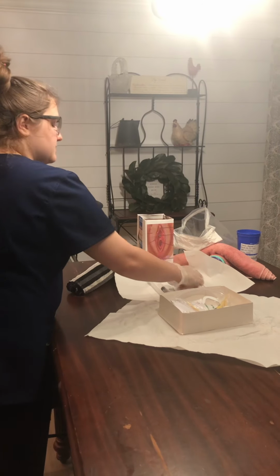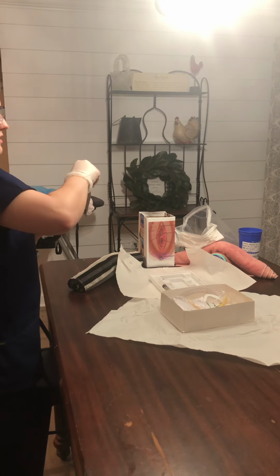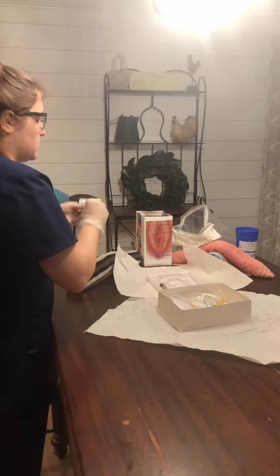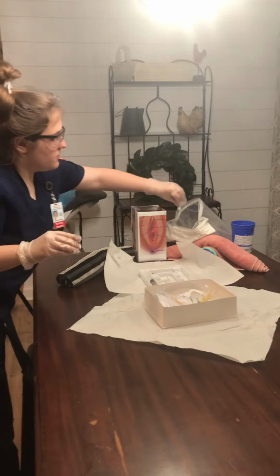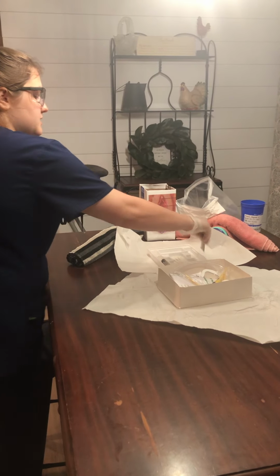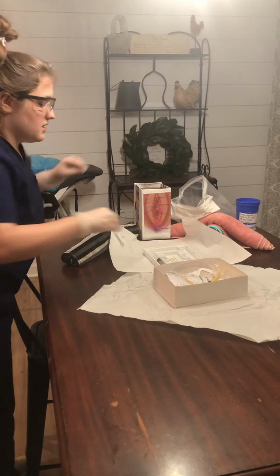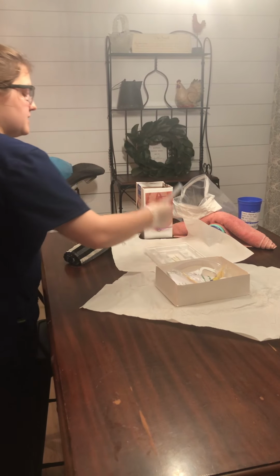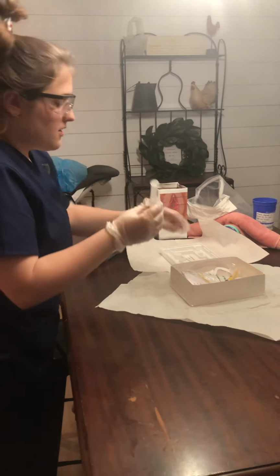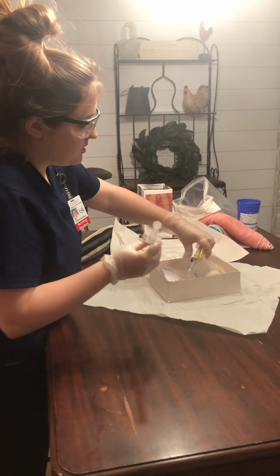Okay, so I'm going to organize my supplies. I'm going to take my 3 swabs out. I'm going to ball that up and throw it in the trash. I'm going to take my jelly out and squirt it into the compartment. And then I'm going to take this out, take the cap off, throw it away, and attach it to my balloon.